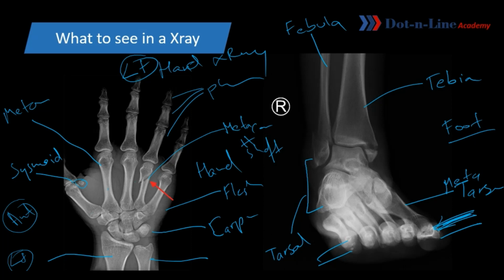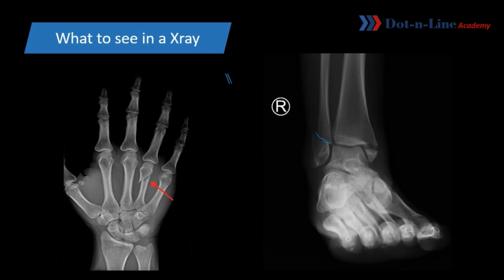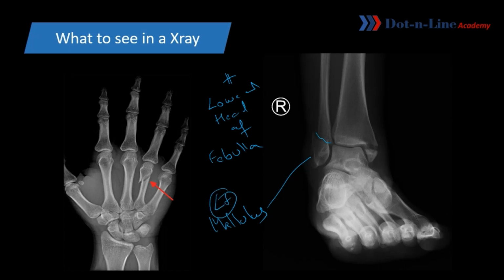We have gone through the general anatomy structures. Now finding the defects. Yes, this fracture you are finding here. It is the fracture of lower head of fibula, and generally what it is called, it is the malleolus, right? Malleolus. Okay, the condylar ends. It is lateral malleolus, the fracture of lateral malleolus.